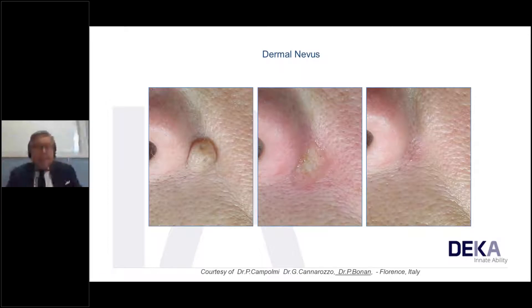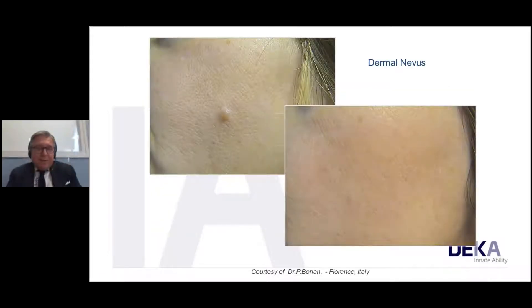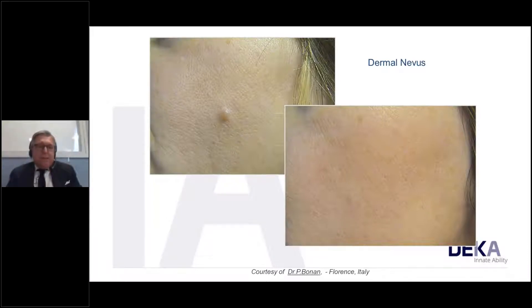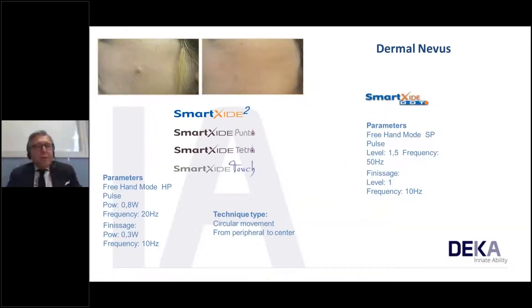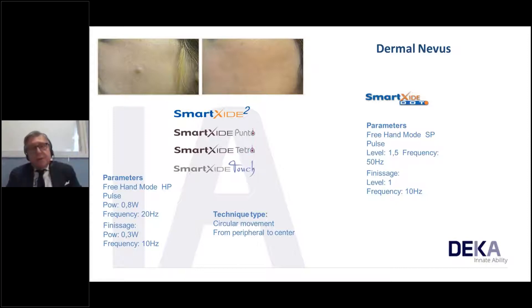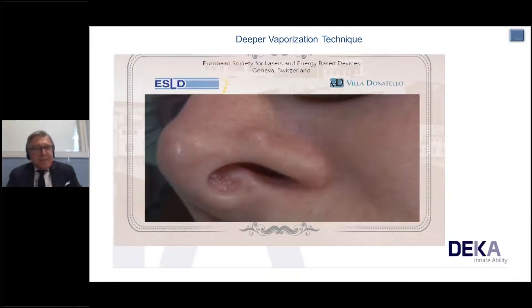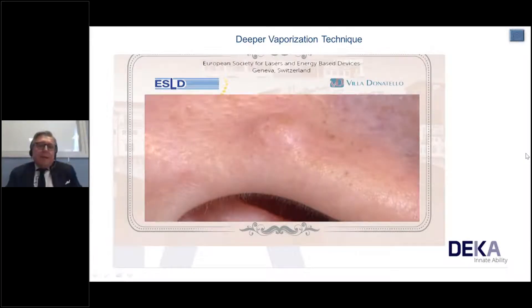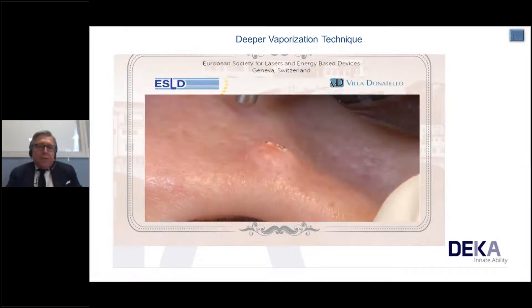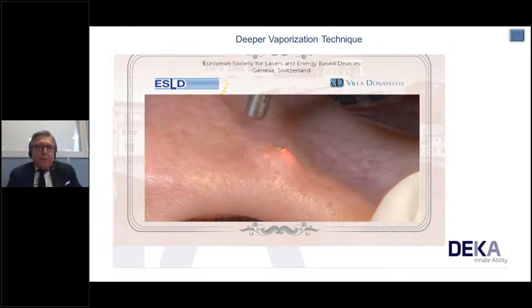A dermal nevus on the middle of the cheek is a very delicate area. Parameters with the new system: freehand mode HP pulse, 0.8 watts, 20 Hz. With the previous system: SP pulse, level 1.5, 50 Hz. In the video, we start by vaporizing the top of the dermal nevus, then reduce the thickness progressively.